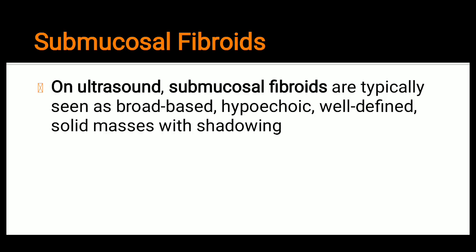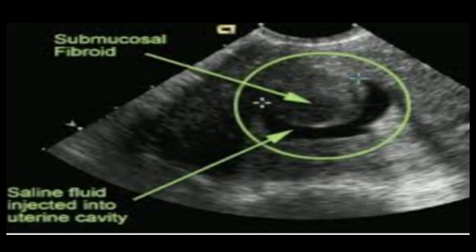Coming to submucosal fibroids: on ultrasound, submucosal fibroids are typically seen as broad-based, hypoechoic, well-defined solid masses with shadowing. With saline fluid injected into the uterine cavity, submucosal fibroids become apparent and you can see these hypoechoic, well-defined solid masses with shadowing.